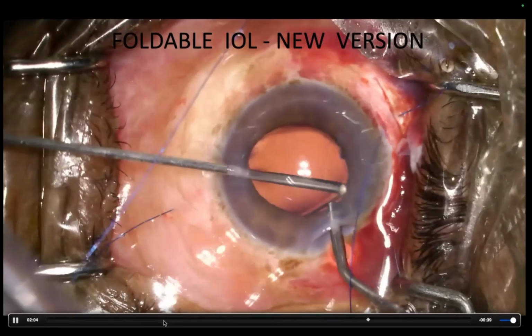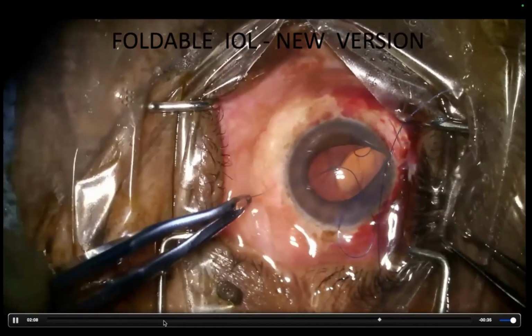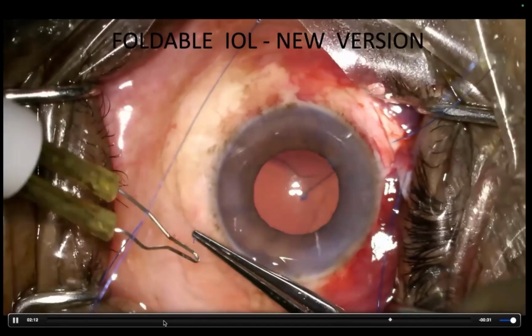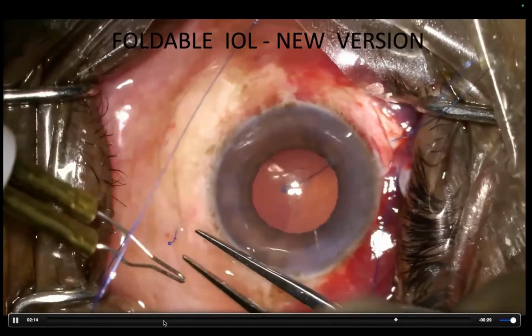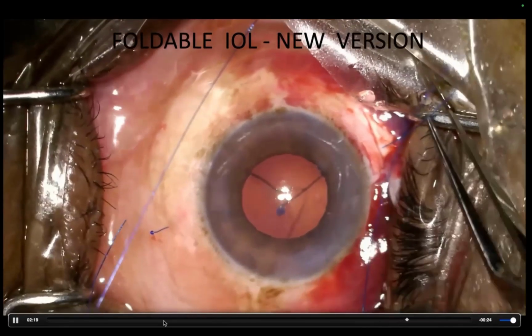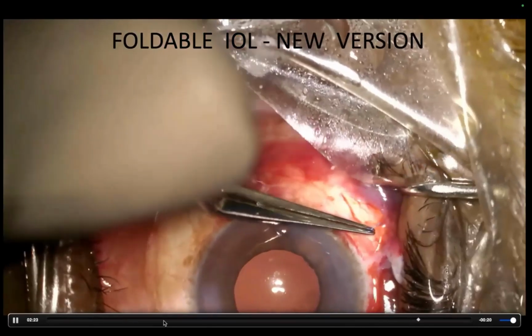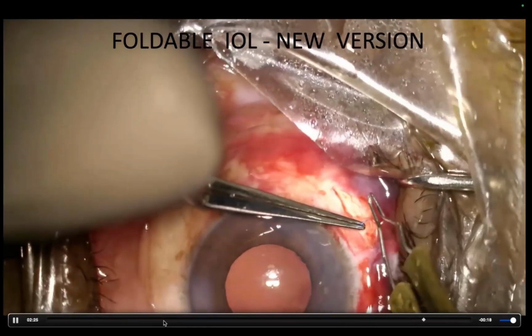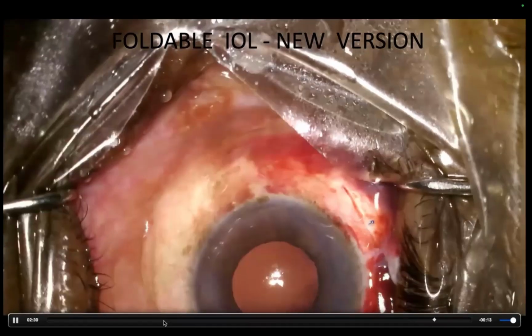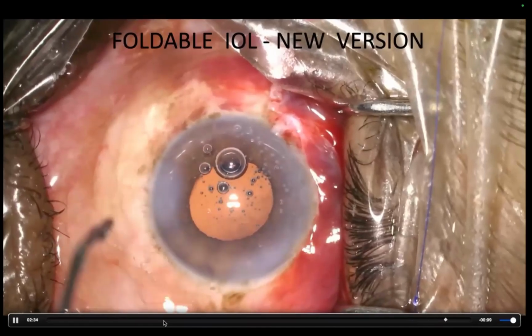The only difference between the PMMA technique and the foldable technique is that in the PMMA technique, you finish the vitrectomy and then you start your flanging procedure. Here, you flange, you put the IOL inside, and only then do your vitrectomy. Because if you do the vitrectomy in the beginning, the eye is going to be very soft and it is going to be nearly impossible to push the IOL inside. So this is relatively very simple. This is what I do as a secondary procedure.